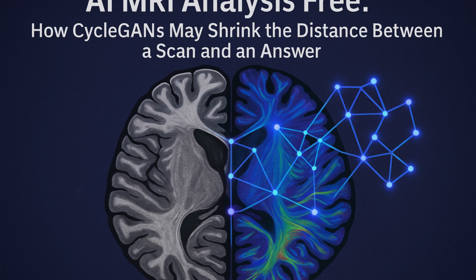The million-dollar question. It really is. And the answer seems to be, it's complicated. Sometimes yes, often no, never absolutely. That nuance is vital. Accuracy isn't a single number. It depends on so many things. Like what? Well, the specific MRI scanner used, the exact imaging protocols, how complex the patient's condition is. The range of human pathology is huge. Exactly. AI might be great at spotting one specific thing it was trained heavily on, but miss something unexpected.